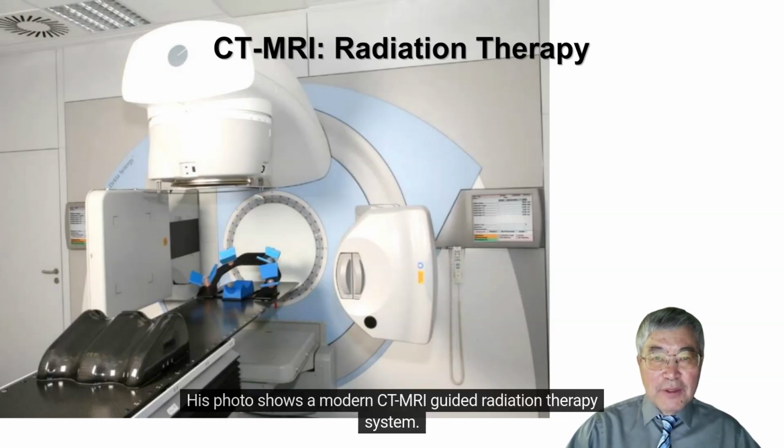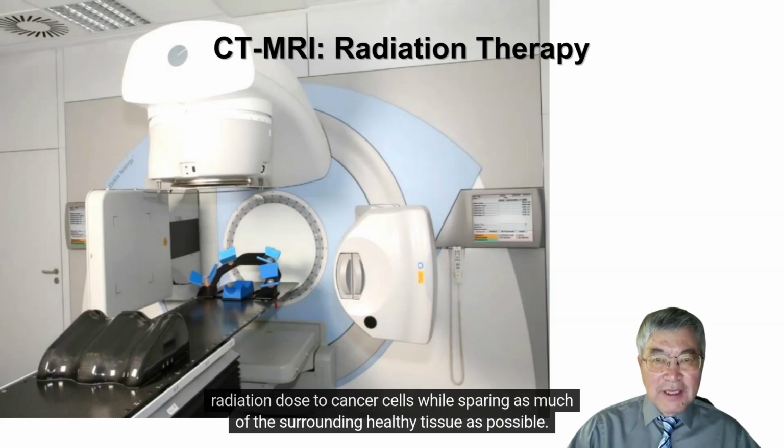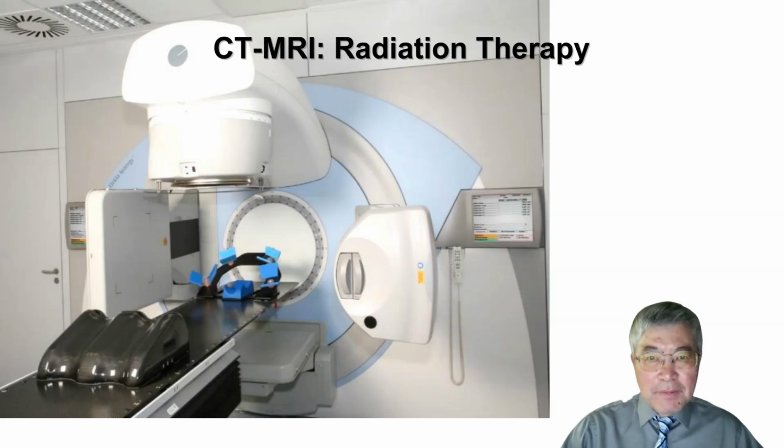This photo shows a modern CT MRI guided radiation therapy system. In radiation oncology, precise targeting of tumors is critical because you want to deliver a very high radiation dose to cancer cells while sparing as much of the surrounding healthy tissue as possible.